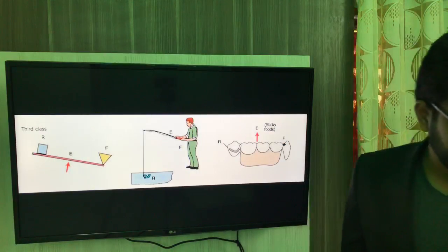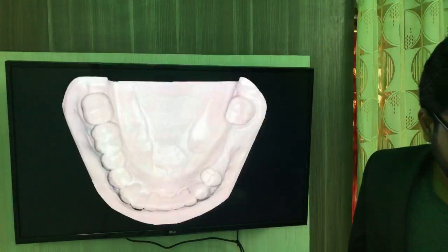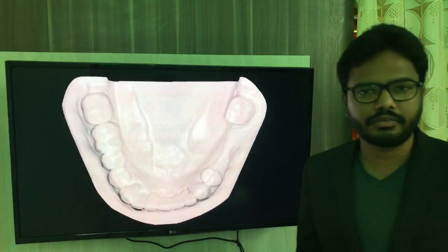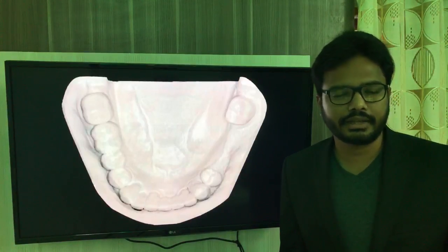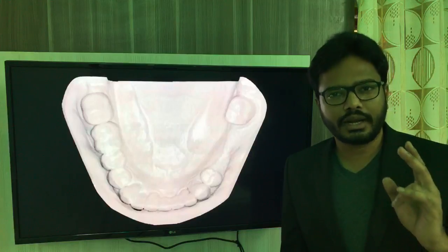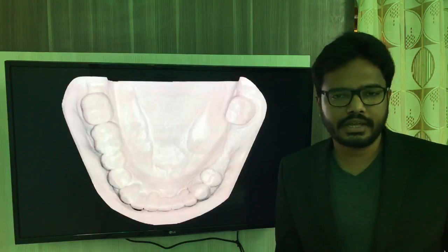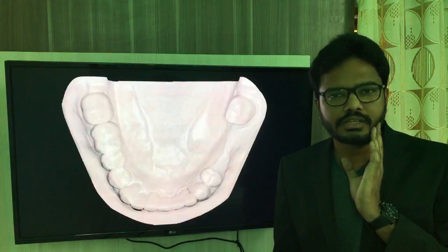So that's very important. And finally we discussed a few major connectors, and before that we also had this identification session. I will not just run through all of this, anyway it's clear for you, right? So the posterior-most edentulous space is going to decide the classification. Class 1 is your posterior bilateral edentulous area. Class 2 is your unilateral posterior edentulous area.